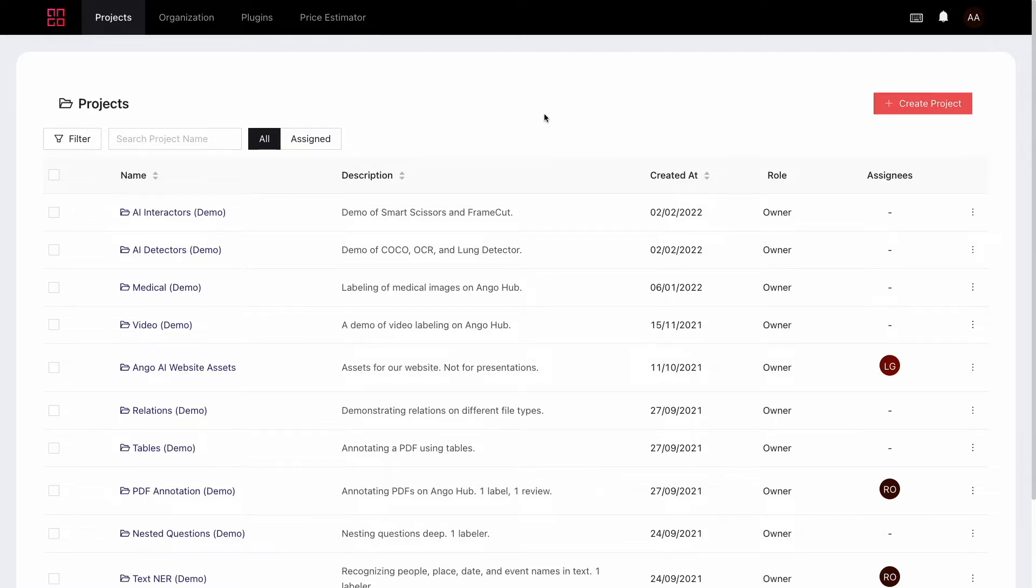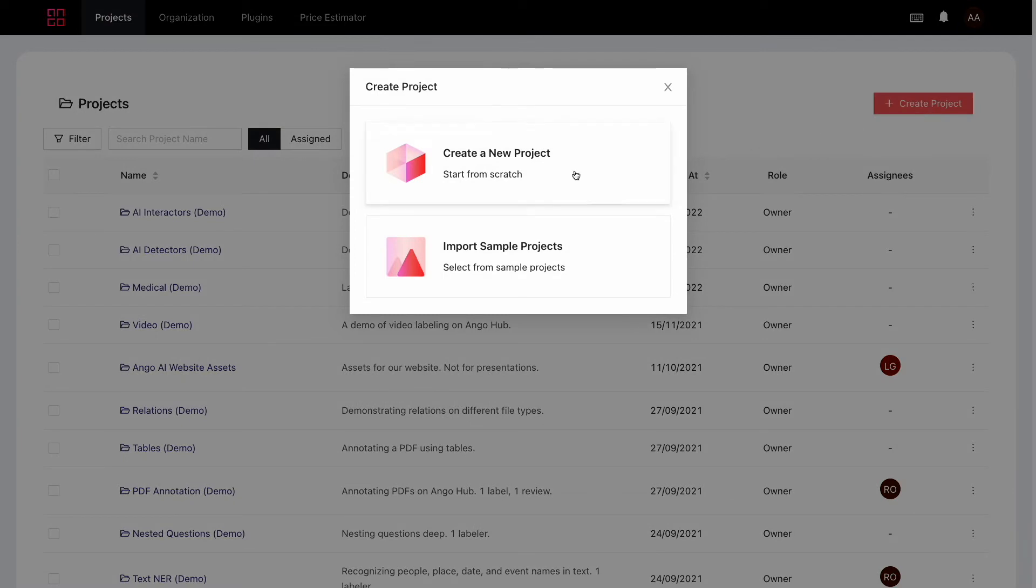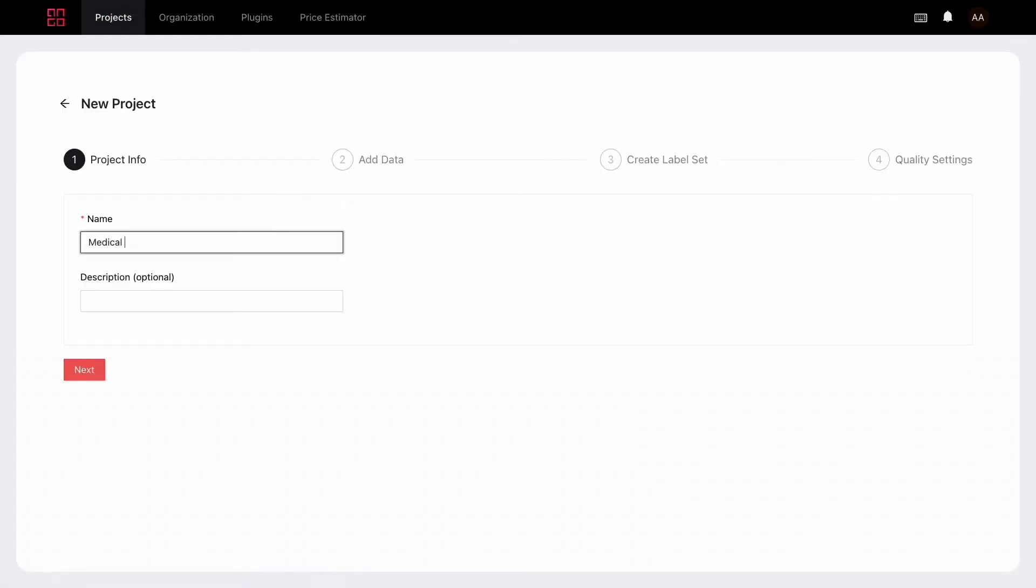So first things first, we need to create a project. I'll click on new project here then start from scratch and follow the wizard.